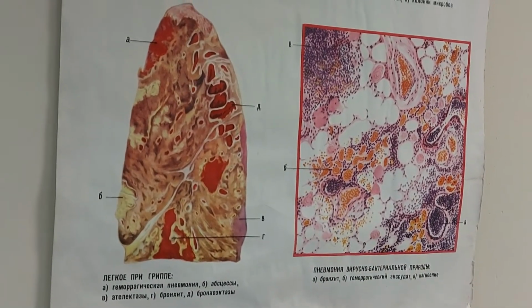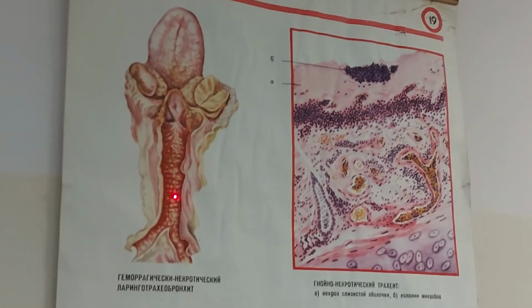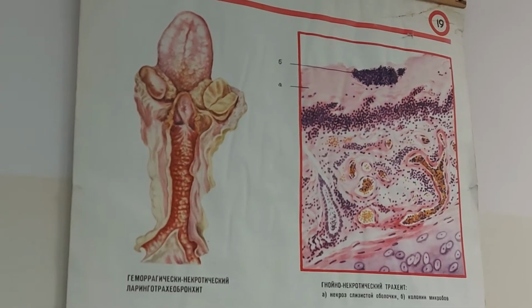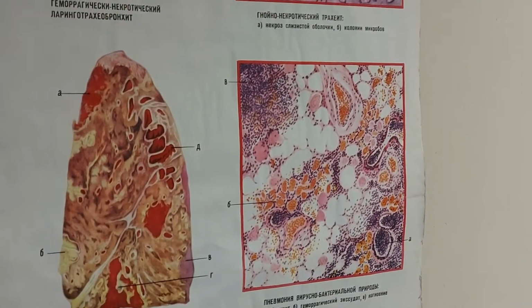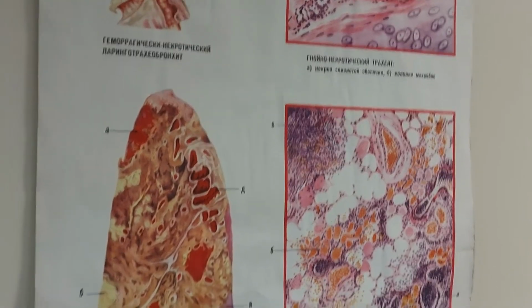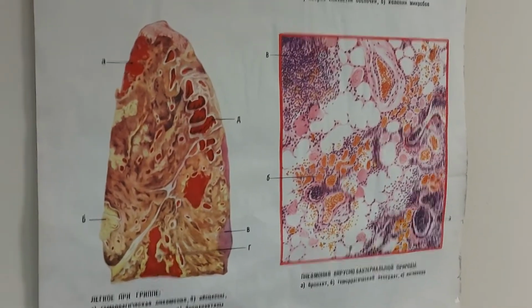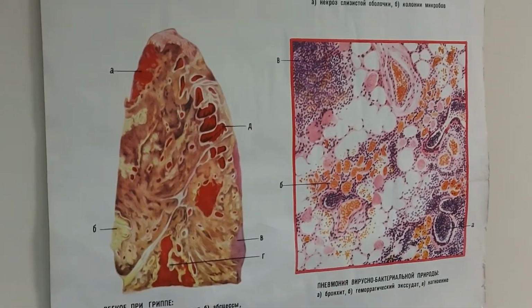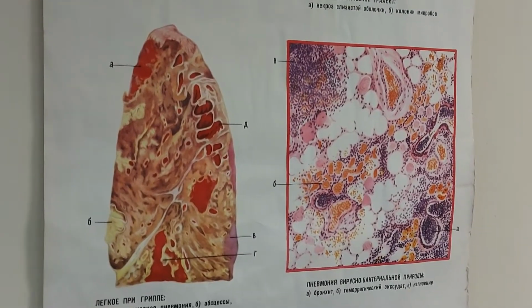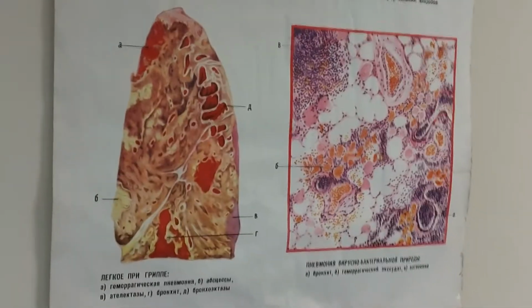And if you see this picture, this trachea, you see some part with pus, maybe a small area. And this pneumonia microscopically is hemorrhagic, suppurative, hemorrhagic, suppurative, together. Why? Because influenza may come together with bacteria. First maybe influenza, but after a few days, a week, you remember about streptococcus, and maybe bacterial and viral pneumonia together.